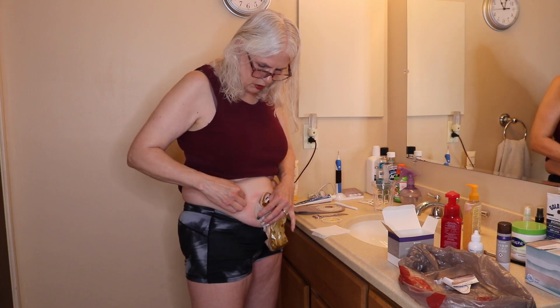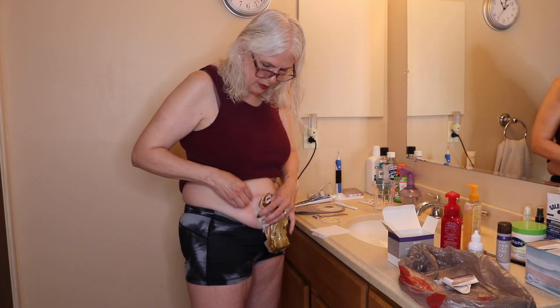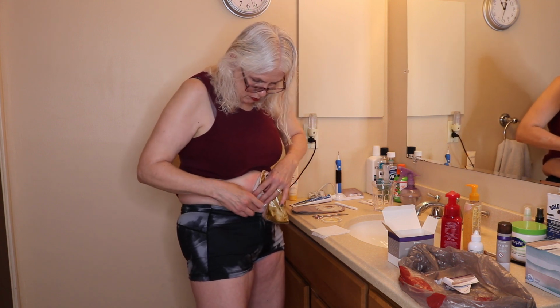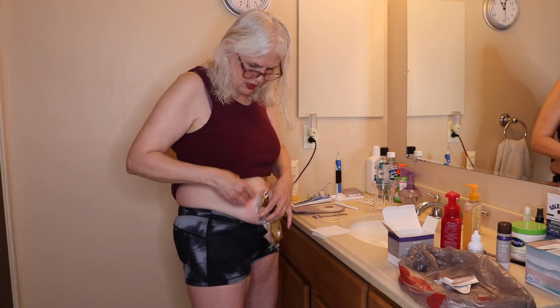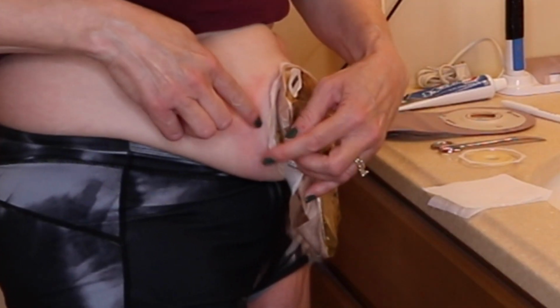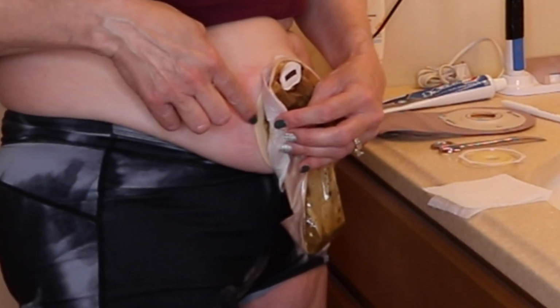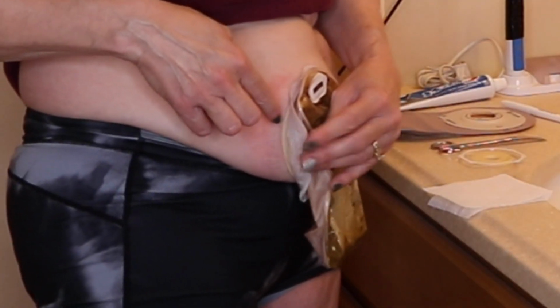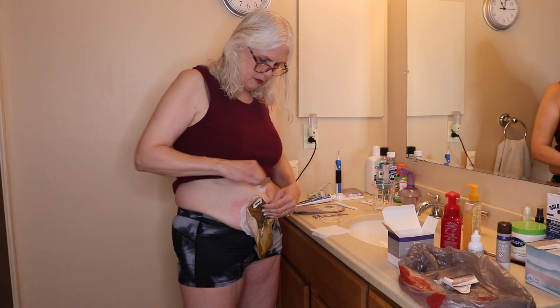The other thing I've noticed, every once in a while, you could have a bad batch of bags. So if you do have a leak with the bag, and then you go and put another bag on, and then you end up having a leak with that bag, you probably have a bad batch. So like right now when I'm doing this, what happened was my tape flange here is separating from the colloidal ring. And I have this box marked that it may be a bad batch of bags.